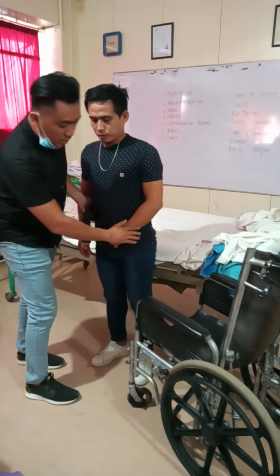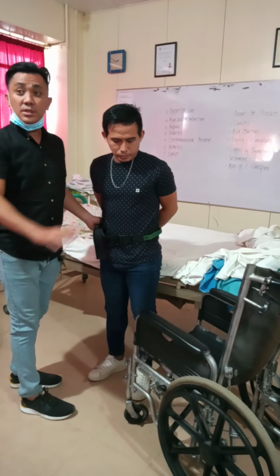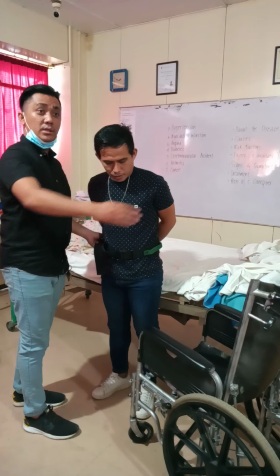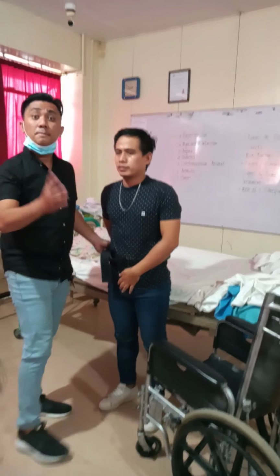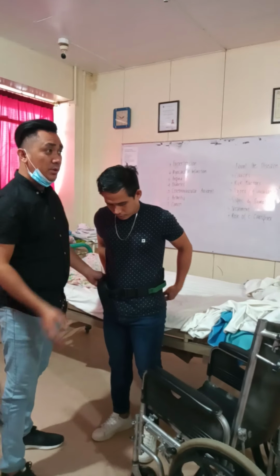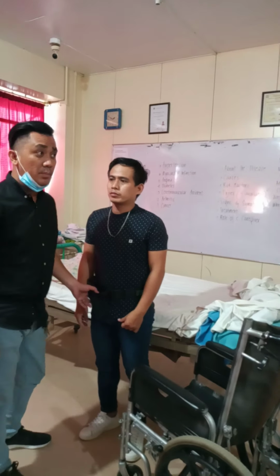That's the reason why we place him closer to the wheelchair, because the good foot moves his body. Do you get it? If the bad foot is the one that moves the body, the patient will feel pain. If both are bad feet, you really have to identify which one is at least stronger.